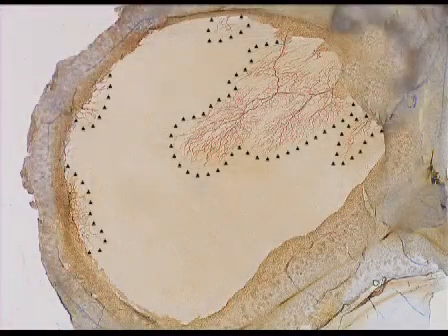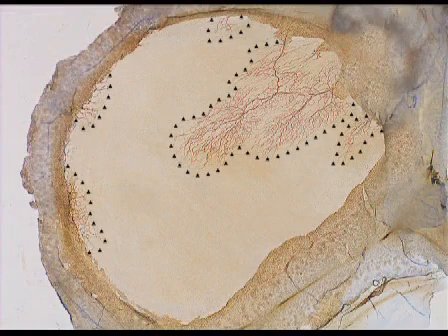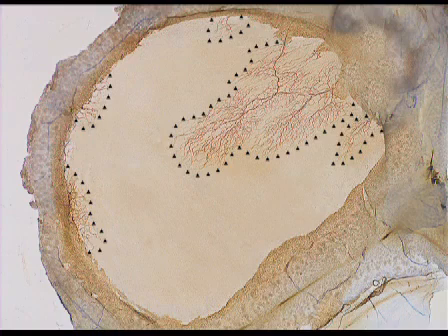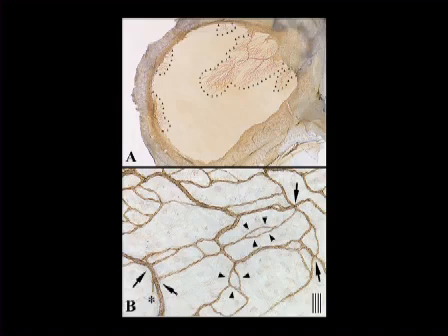In native form, the mesenteric windows in rats normally contain a relatively small number of little blood vessels located on the periphery. In adult rats, these mesenteric windows are natively only between 5 and 10 micrometers thick. This enables intact tissue to be spread on slides and observed microscopically, thereby enabling all the vessels in every window to be observed and giving the vessels what is essentially a two-dimensional extension. The method offers an unrivaled opportunity to make quantitative measurements of the spatial extension, density, pattern formation, and size of the blood microvessels.